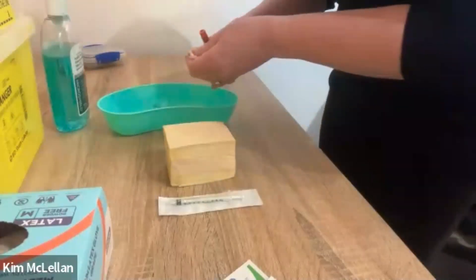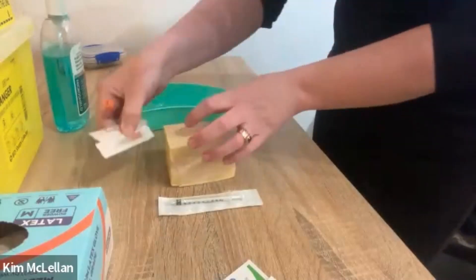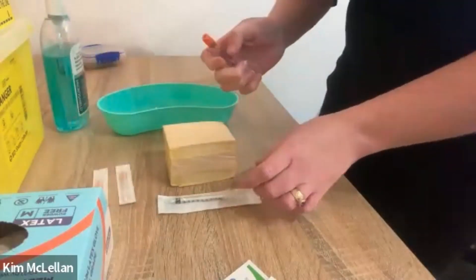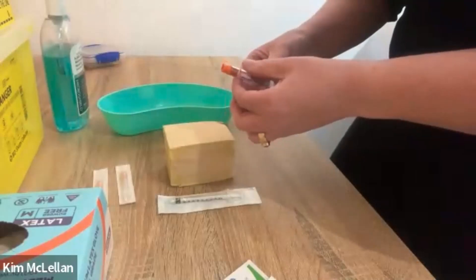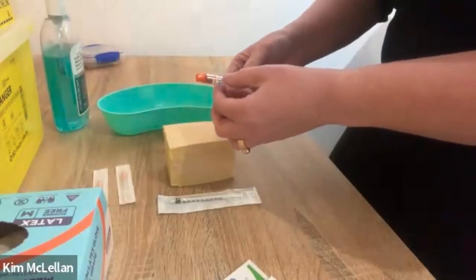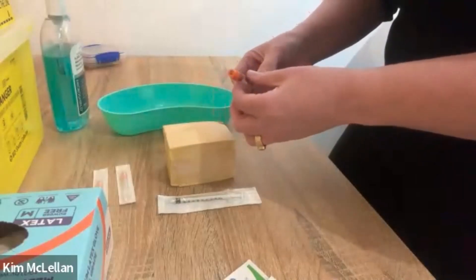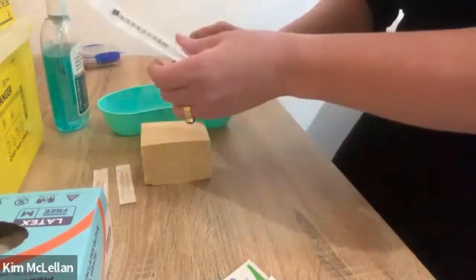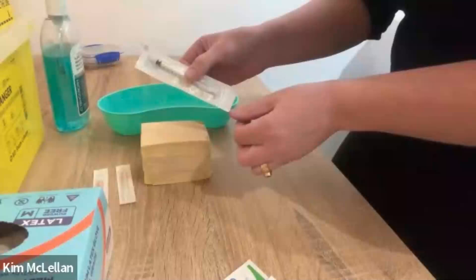Our patient is charted 30 units of insulin and we have a one mil syringe, so we need to do our calculation based on that. Our patient is to have 0.3 mls of insulin via a normal one mil syringe.